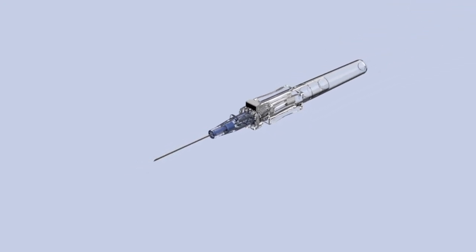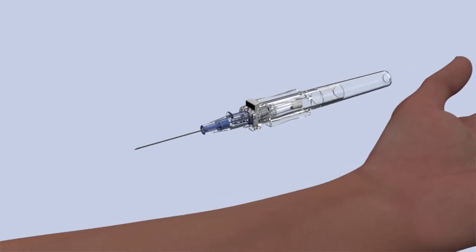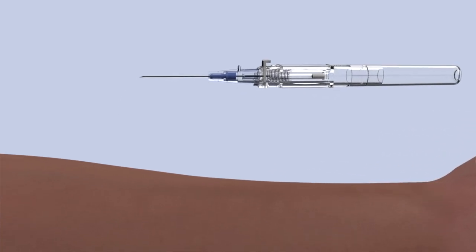For skin preparation and management, follow local protocol. Hold the catheter in the dominant hand and approach the vein at a low angle.